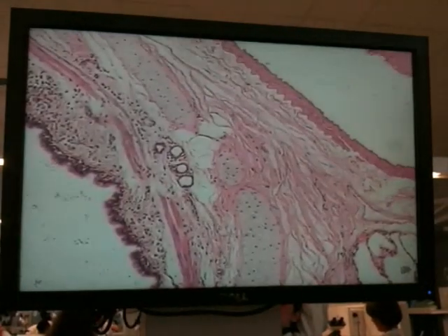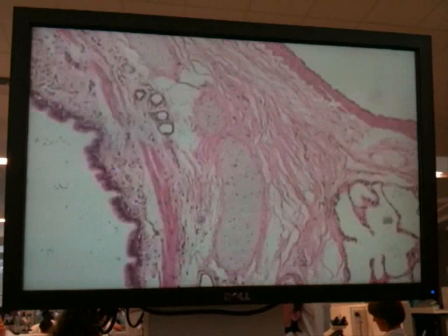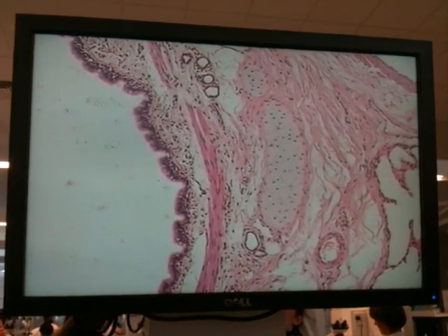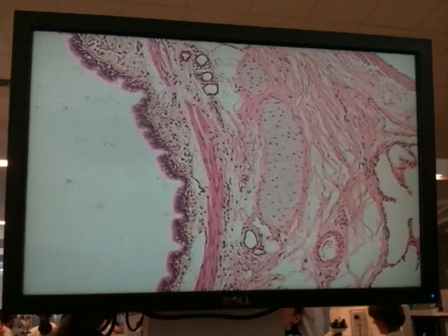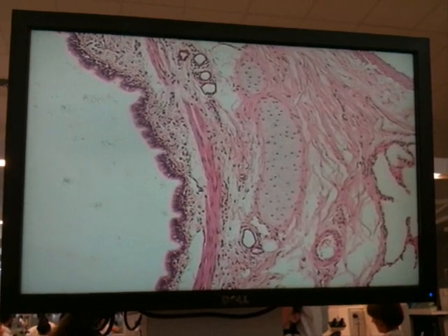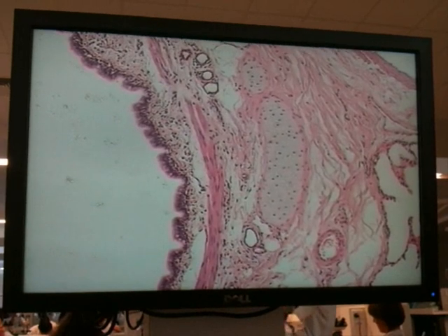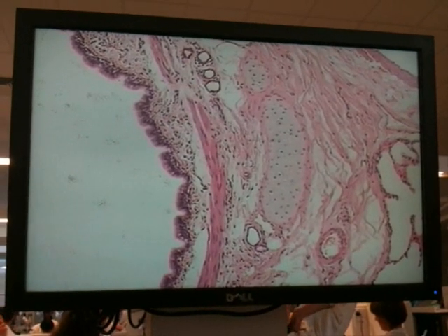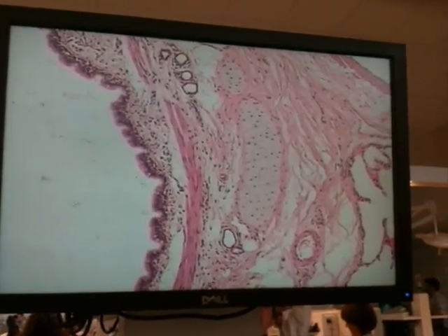If we go to medium power, you can see a nice island of cartilage sitting just to the right in the middle of the screen. We've got the mucosa on the left side of the screen. In between the cartilage and the mucosa, we've got a long vertical pale pink feature, and that is the smooth muscle of the bronchus. Remember, we've got layers of smooth muscle in the bronchus to control its size.